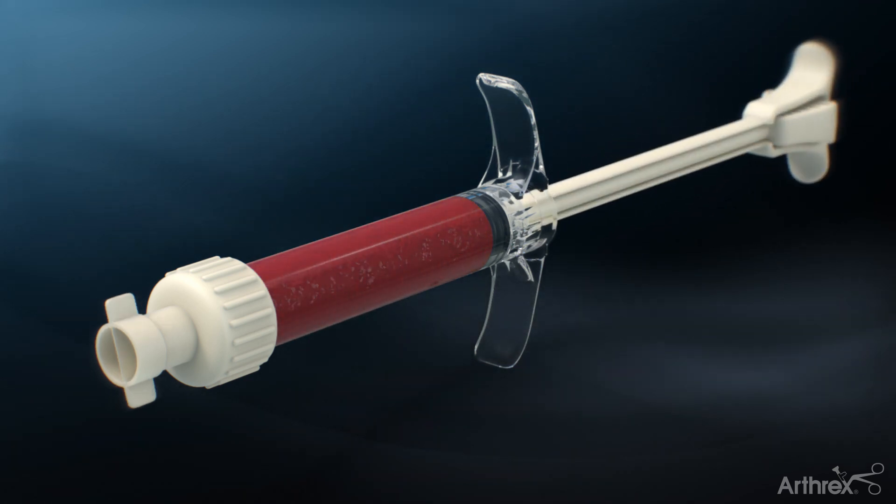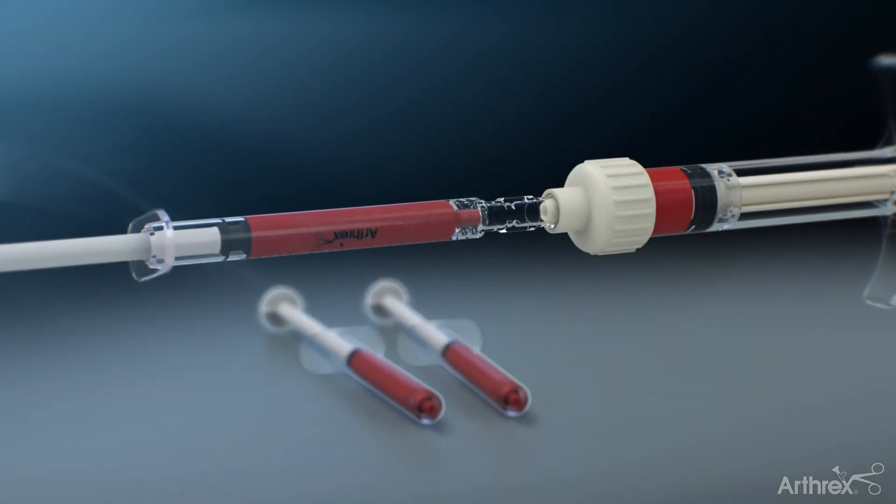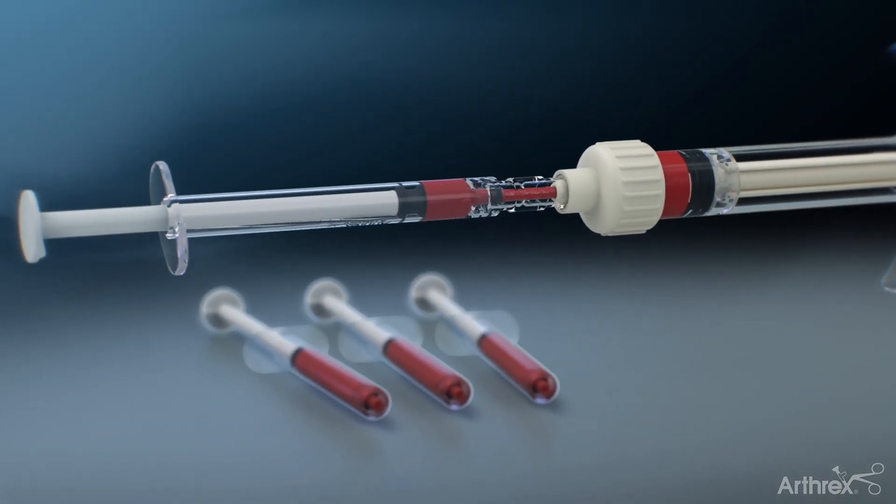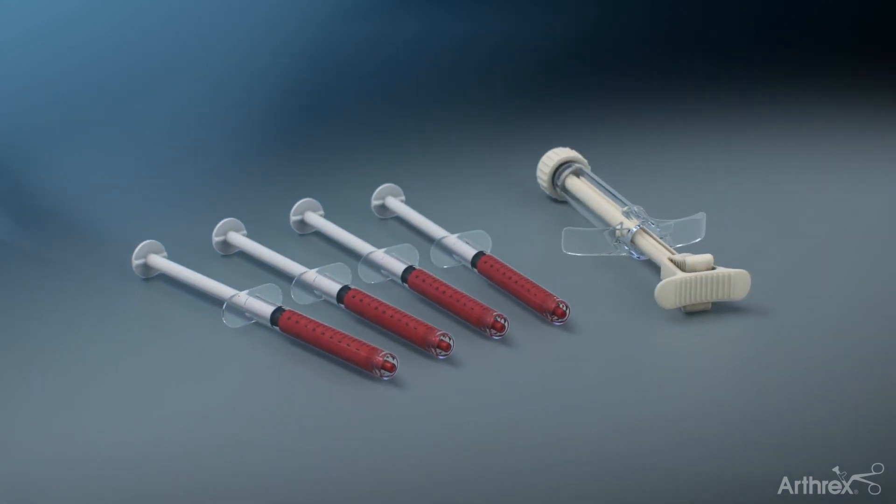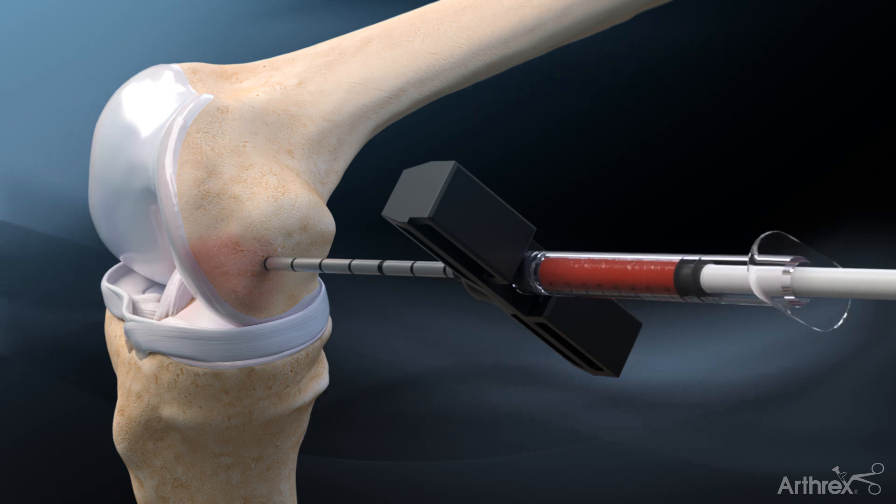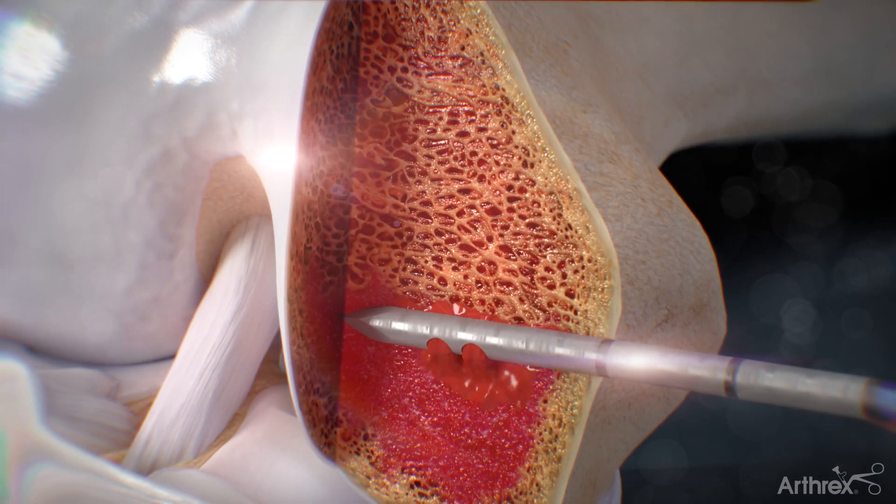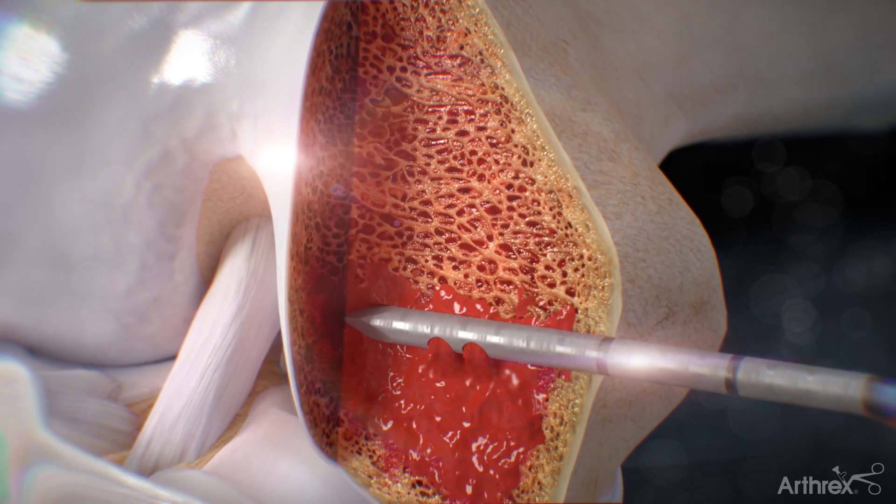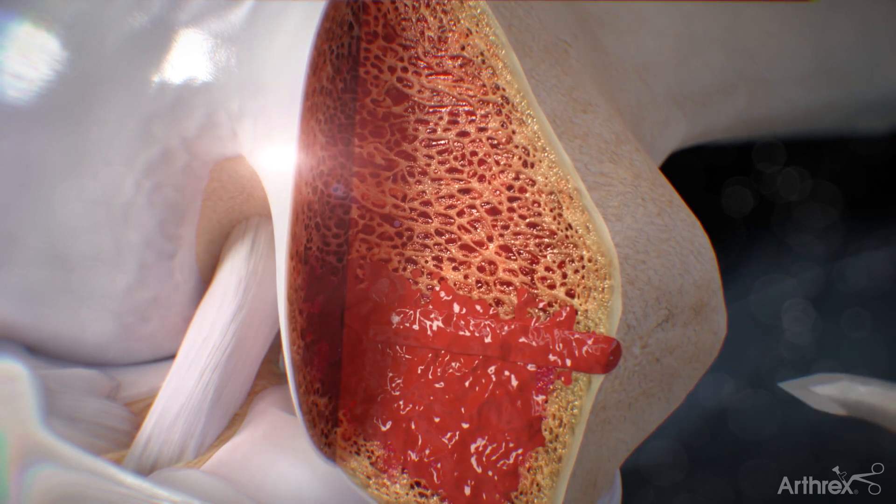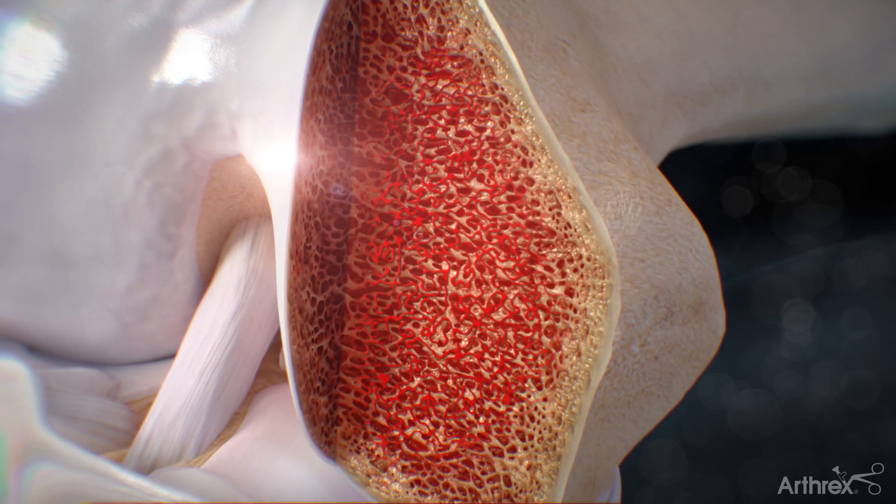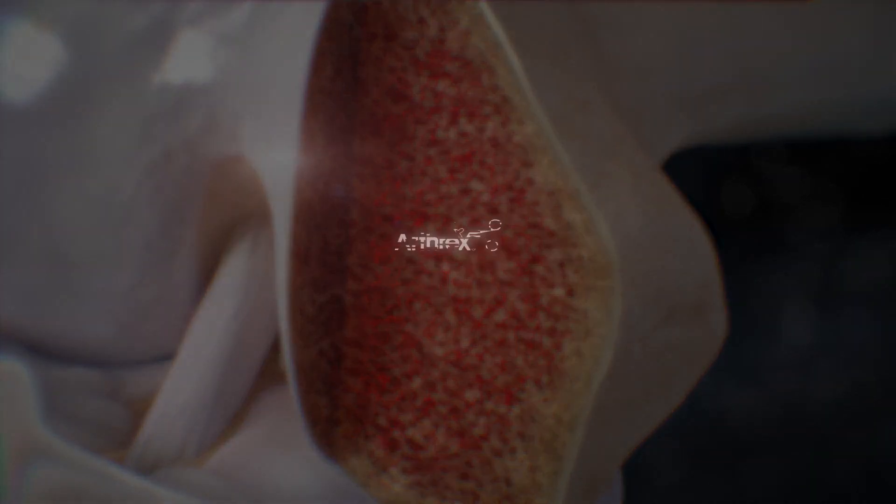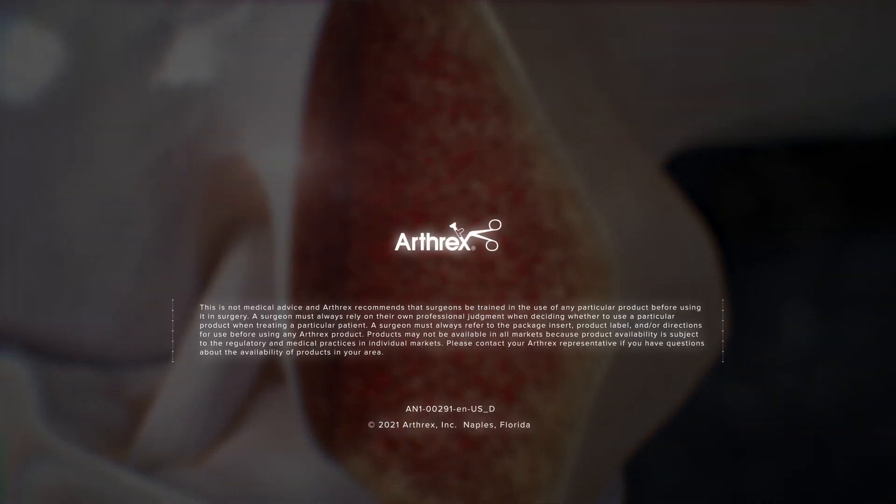Pull back on the mixing element and snap the pushrod back onto the mixing element. The BMA and AlloSync Pure mixture is then transferred to multiple 1cc syringes and then delivered directly into the lesion.